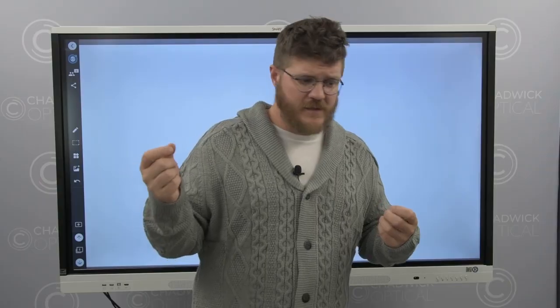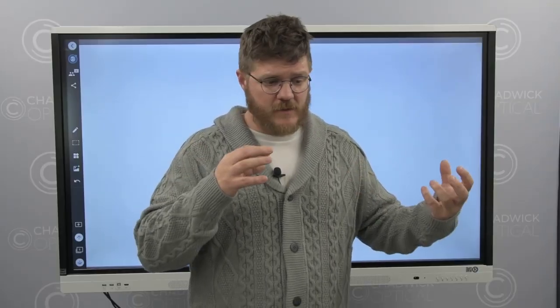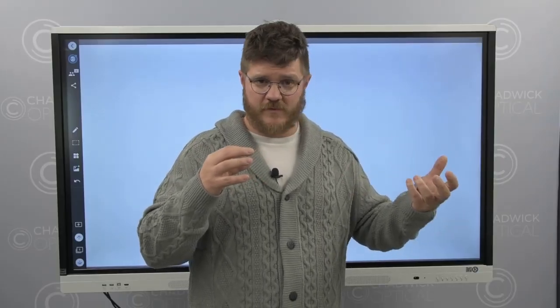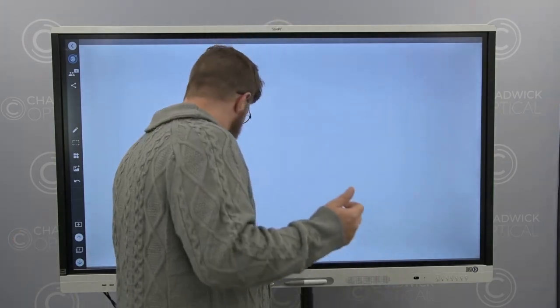Measuring the focal length needed is a much more effective means of calculating magnification than the X. There is no real equivalent between diopters, which is the focal length measurement, and X, which is the magnification measurement. There are multiple different ways that X can be calculated. Nobody talks about which way they used, so you just can't trust X when it comes to magnifiers.